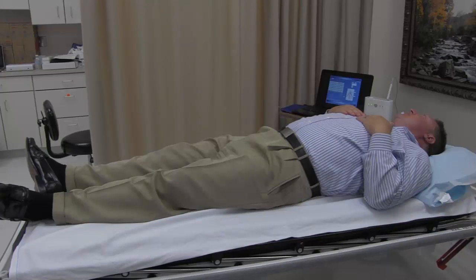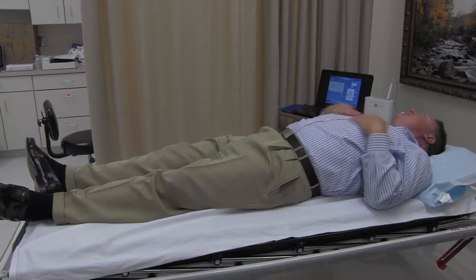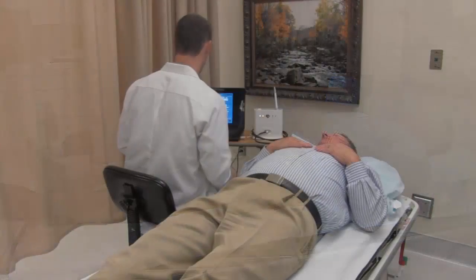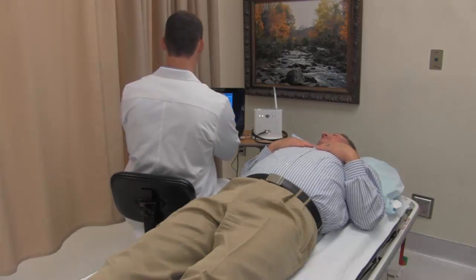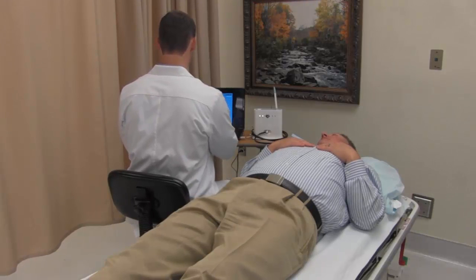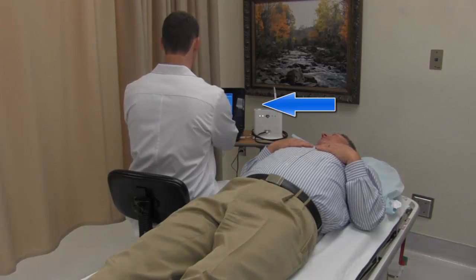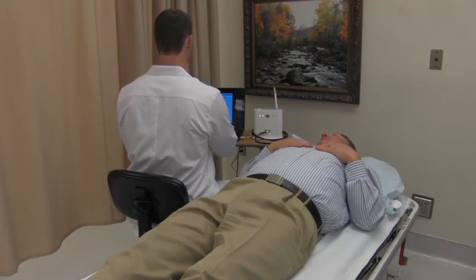It is important when conducting a pulse wave velocity assessment to arrange the room so that the computer screen can be easily viewed by the operator during data capture. In most cases, this is achieved when the computer is placed next to the head of the bed or exam table — the same end where the patient's head will rest. If the screen is in a position that is difficult for the operator to view, it could make data capture challenging.